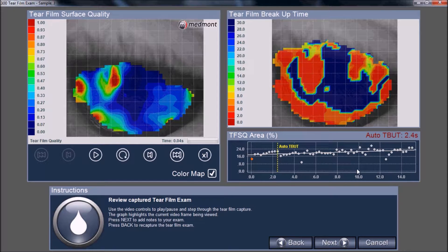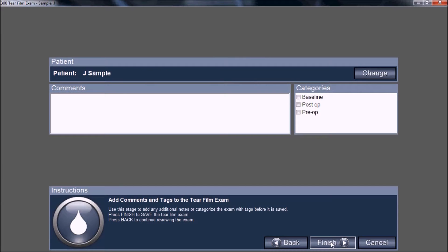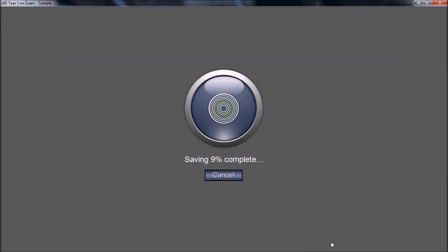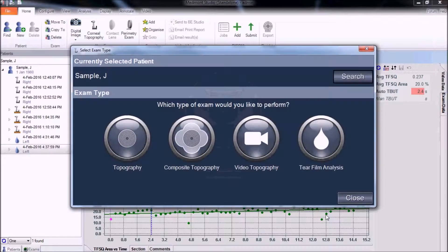Once the capture window has completed its 15 seconds or the third blink has stopped the video, select Next and Finish. This saves those images to the patient file, allowing you to assess the dry eye condition of this patient.